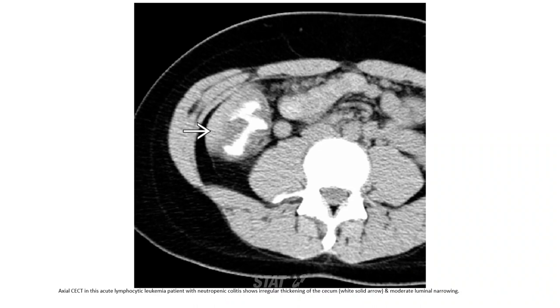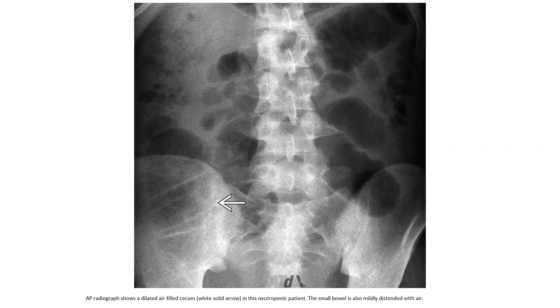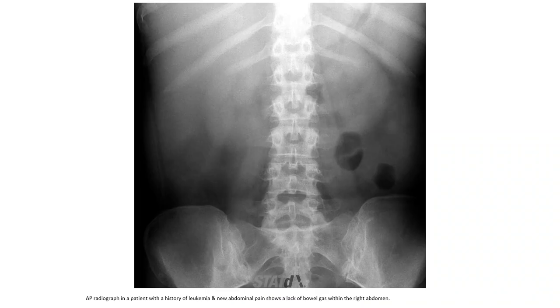Contrast-enhanced CT in an acute lymphocytic leukemia patient with neutropenic colitis, showing irregular thickening of the cecum and moderate luminal narrowing. AP radiograph shows a dilated air-filled cecum. In this neutropenic patient, the small bowel is also mildly distended with air. AP radiograph in a patient with a history of leukemia and new abdominal pain shows a lack of bowel gas within the right abdomen.